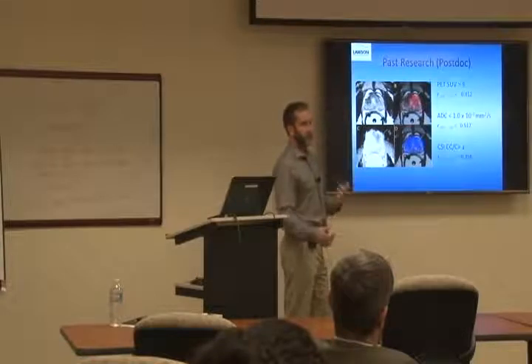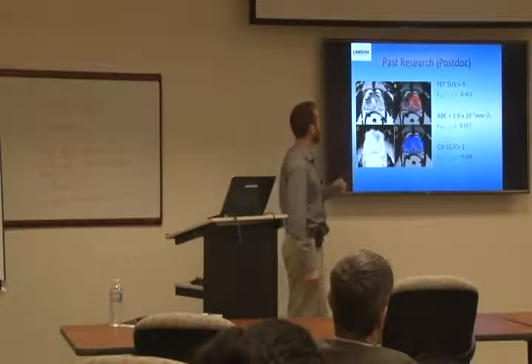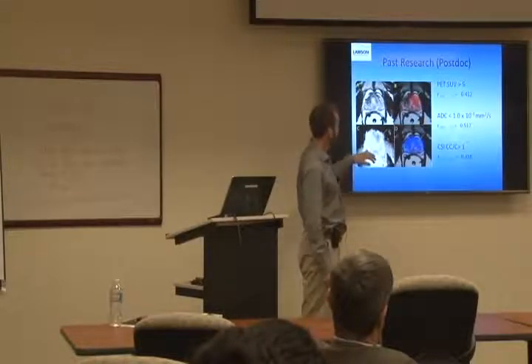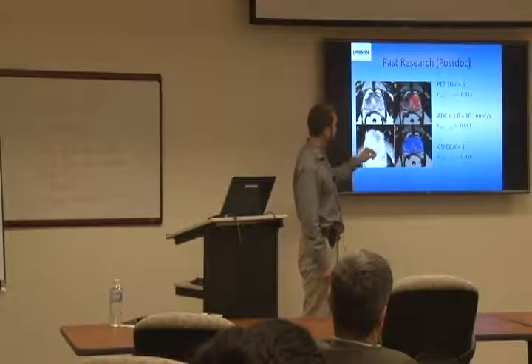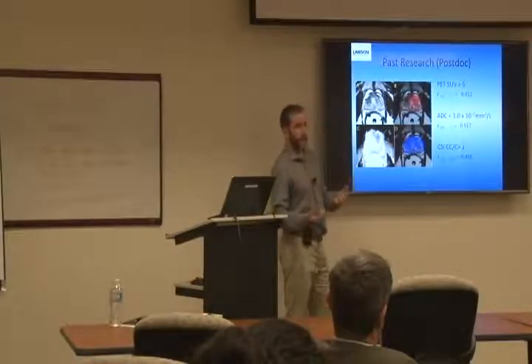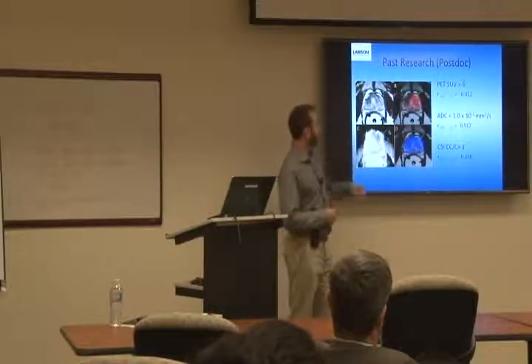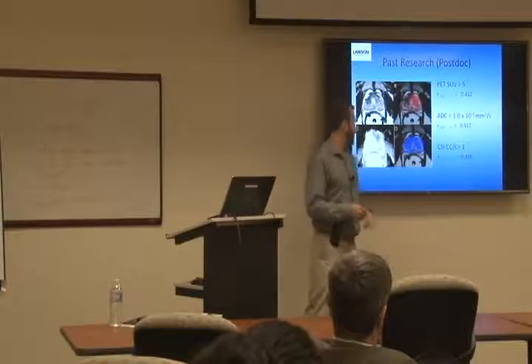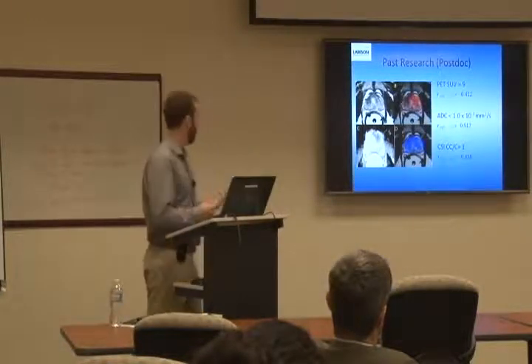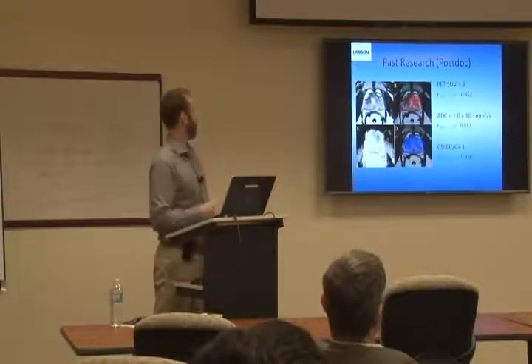And they've actually designed some radiotherapy applications around this tracer and how specific it is. But we were just looking at it with a PET scanner. We also acquired some diffusion weighted imaging. And you can see the dark spot here. You get increased cellular density, so reduced diffusion in tumors, so we see a nice dark spot there. And then we also acquired some CSI, so 3D spectroscopy images, and we looked at the metabolite ratios, and it was as we would have expected.